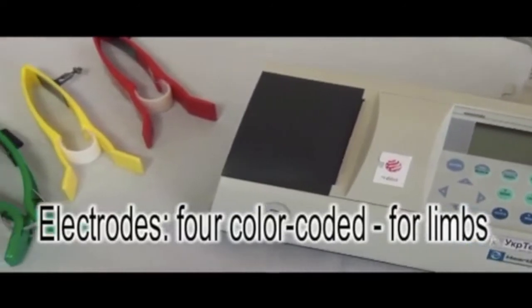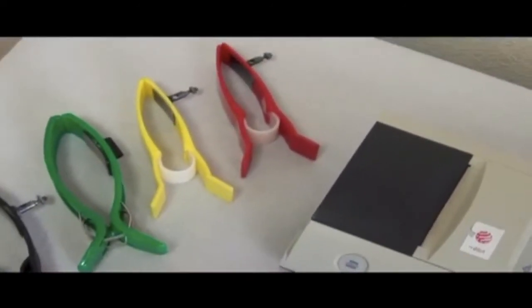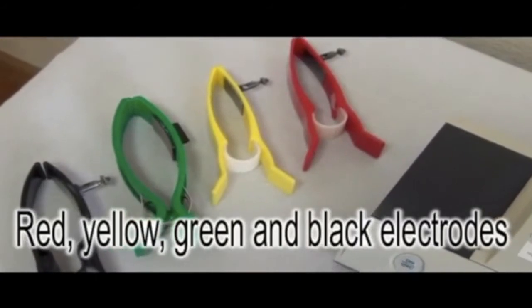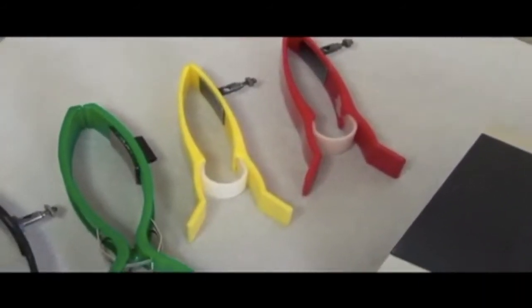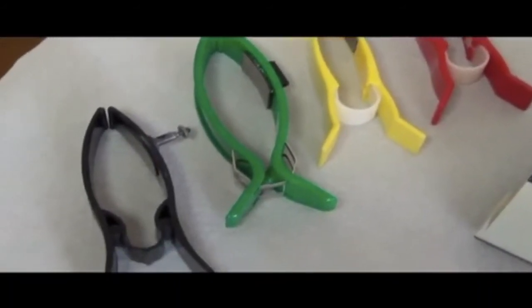Four colored electrodes, which will be put on the hands and legs, have colored markings. Red electrode for the right hand, yellow for the left, green for the left leg, and black for the right leg.